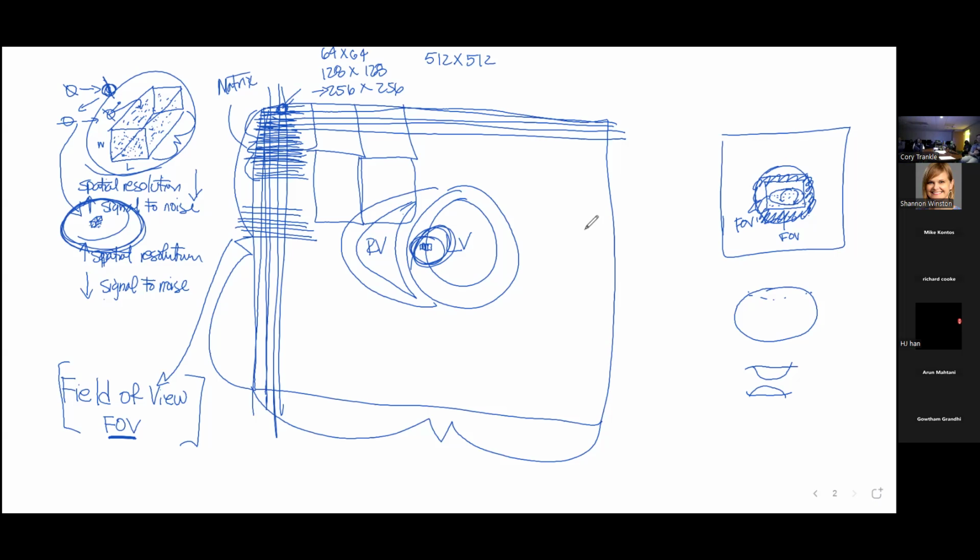If you're doing a nuclear study and you're handling the radioisotopes, remember the little syringe with the little lead thing, you're giving the same amount. When you turn on the echo machine, you're just turning it on. You're not really adjusting power and transmission and all that kind of stuff. It's done for you. In this technology, every single time you get every single picture, you are making an adjustment, because you're writing a computer program. Now, for most of you, that's already been done.